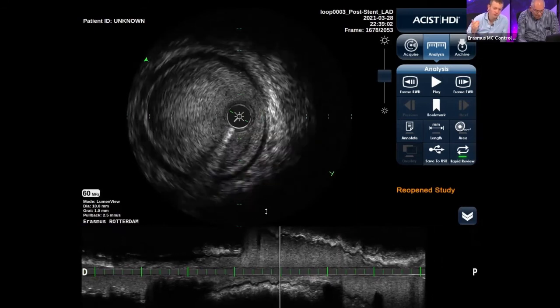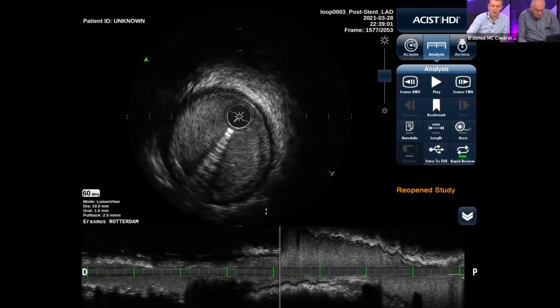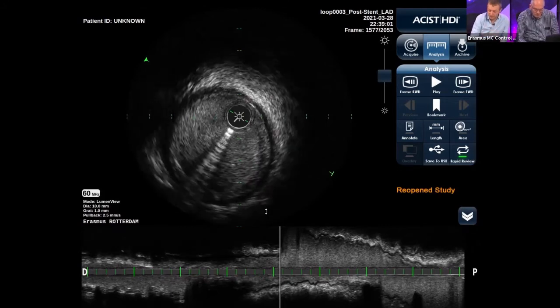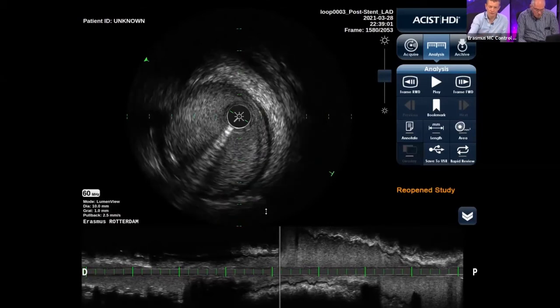If you want to use it for stent sizing, always pick large side branches as your reference. IVUS obviously doesn't have the easy-to-use co-registration features like OCT, but in my experience, if you learn to identify the key landmarks on IVUS and merge them with the angio, which is actually very simple because you see the ostium of the circ on the angio, and also on the IVUS you can clearly appreciate where the ostium of these large side branches is, you can adjudicate on the IVUS how far in the stent needs to be, or whether or not you need to cover a bifurcation. And that's why we always, no exceptions, do motorized pullbacks.